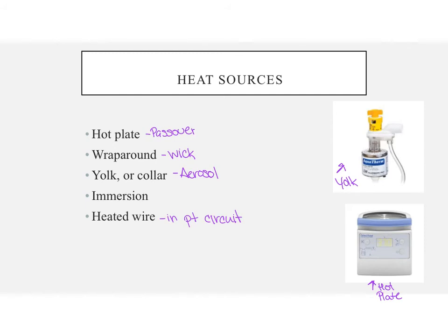And then it can control and adjust the heater to achieve the desired airway temperature. So this bottom one is going to monitor. If you can zoom in on your PowerPoint, you can see a little picture and it'll light up and tell you where the heat is alarming, if it's too hot, if it's not receiving heat at all.